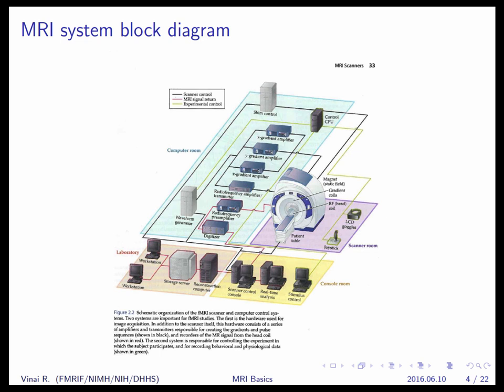The parts that you don't see, and the part really where the magic happens, is all the supporting electronics for the scanner. Behind, usually in an equipment room tucked away somewhere that's relatively cold and noisy, there are high-powered amplifiers that we'll talk about later on in the imaging portion, and then there's radio frequency hardware. And this is one of the nice things about MR versus other imaging modalities, and it's one of the things that actually got me in the field from early on: the quote-unquote radiation that's used is non-ionizing.